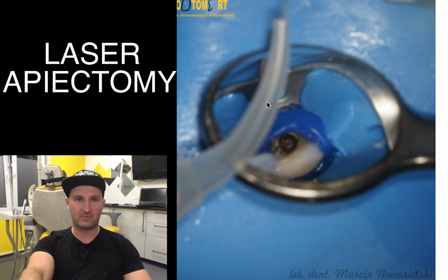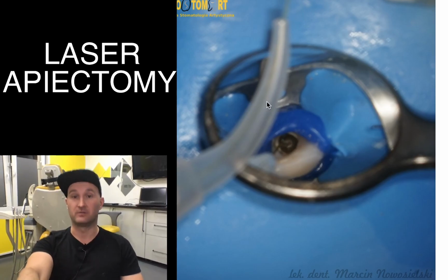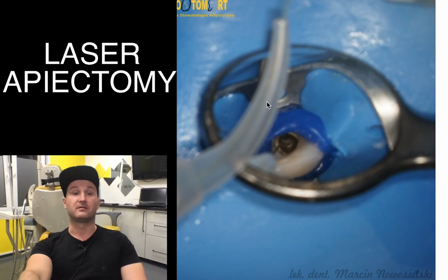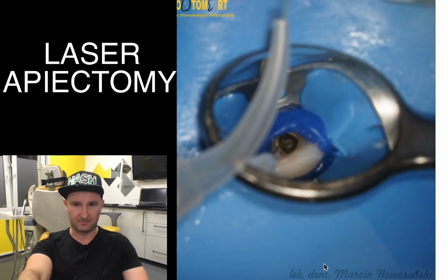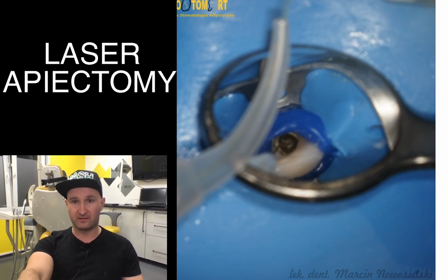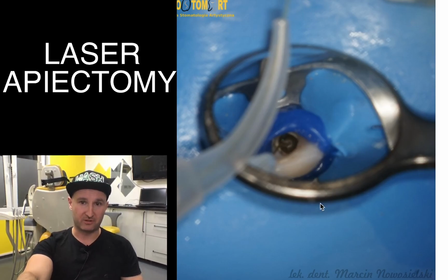We can kill much more bacteria if we compare it to just irrigating the solution. And as you will see at the end, this makes our treatment much more effective and the healing much faster.